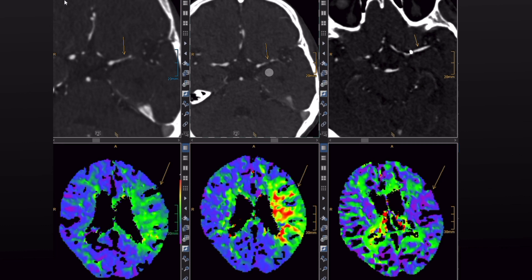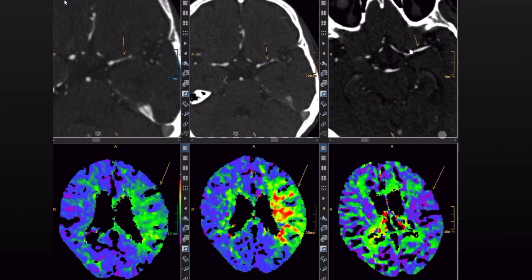Here we have the follow-up. As you can see, she now has a subtotal occlusion of the left middle cerebral artery with a severe perfusion deficit in almost all the MCA territory on the left side. So we performed an acute mechanical recanalization, and here you can see complete resolution of the middle cerebral artery stenosis and complete resolution of the perfusion deficit.